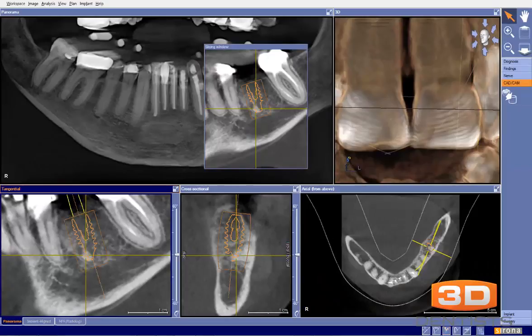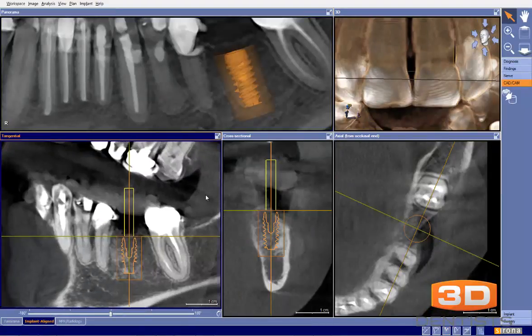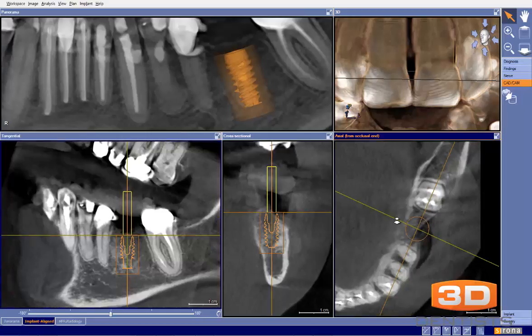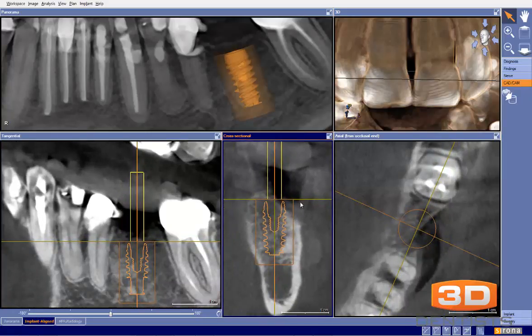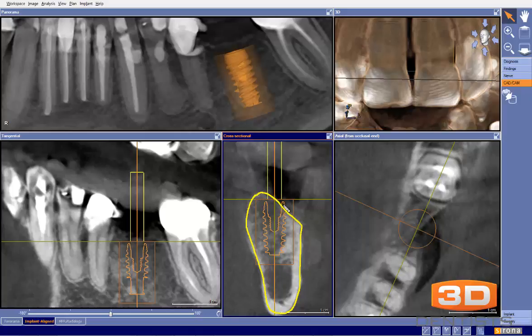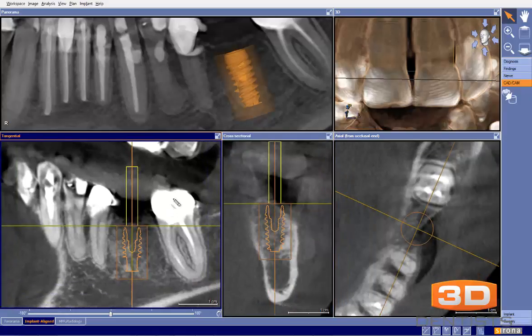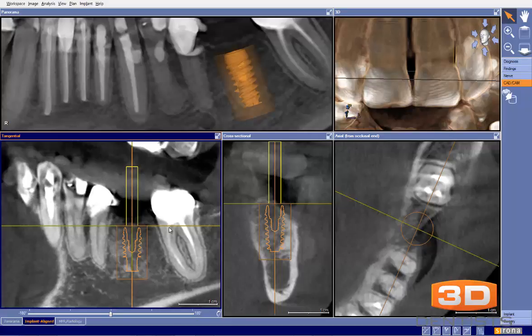Now let's focus on our actual implant plan. A couple of things I see right away: one, we do have a ridge defect here. I'm going to outline our ridge, and we can see that our implant is going to be slightly outside our ridge there, probably necessitating some grafting. Also, what I see right away is that our occlusal plane is off. In an ideal world, we would like this to be flat. So that's just an implant positioning issue.